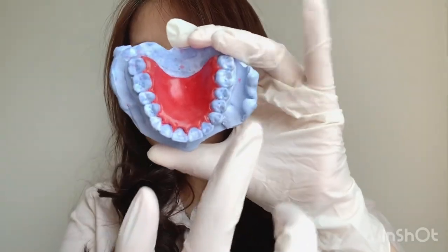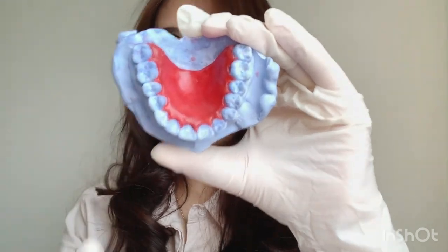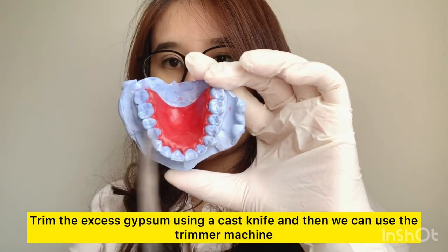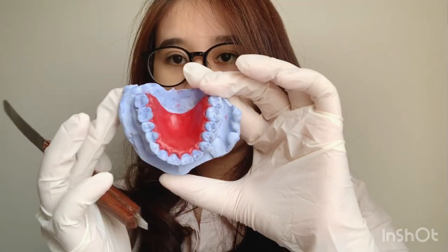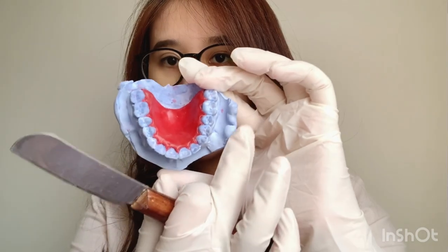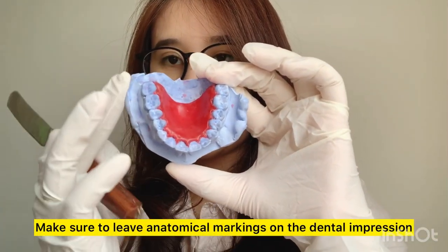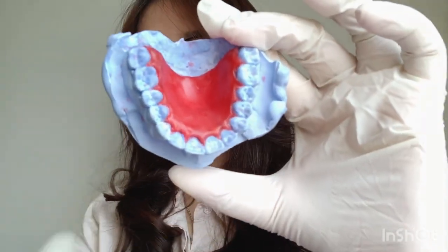So in this video, I'm using the other dental impressions to demonstrate the steps of making a study-based model. The first step is we should trim the excess gypsum using a cast knife. And then we can use the trimmer machine that is already available in the laboratory, and make sure to leave anatomical markings on the dental impression.